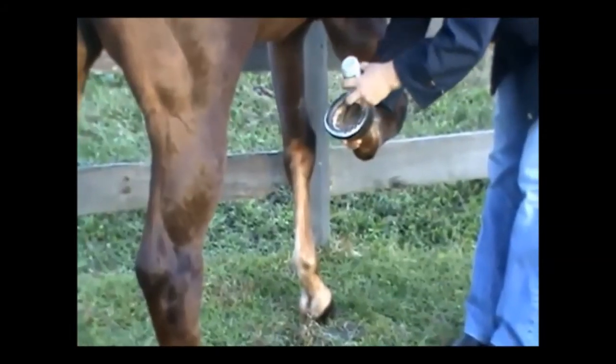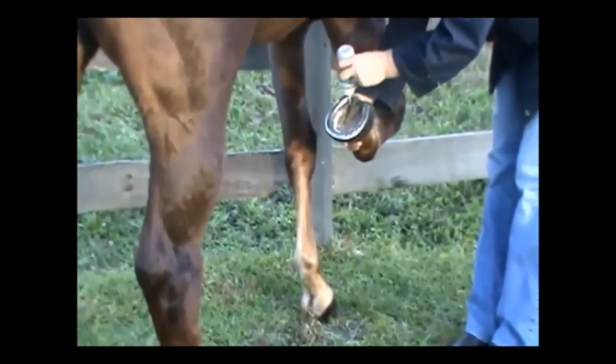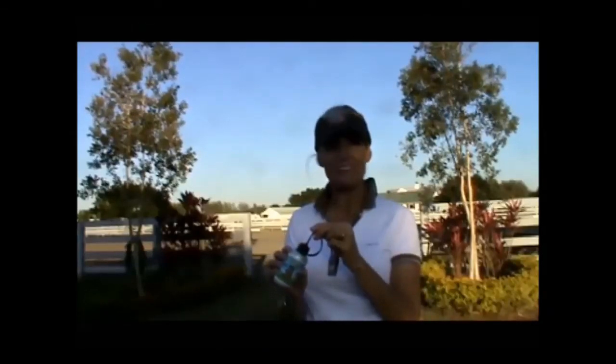"All of us have had to deal with thrush — it's a messy, disgusting disease that happens to many horses, far more than we'd like to think about. The great thing about this bottle is you can put whatever medicine you want in it. When the horse has thrush and the frog begins to heal, the crack actually becomes very narrow and tiny and it's hard to get anything in there. So this is sort of a perfect idea. I think every horseman should have one and will have one."